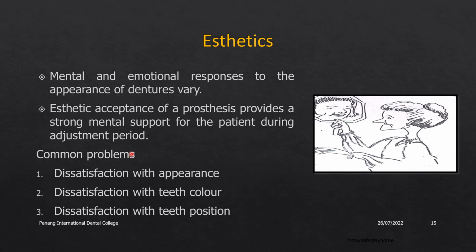Some common problems that may be seen are dissatisfaction with the appearance. Maybe the patient is not specifically satisfied with the teeth color. Maybe he wants whiter teeth than the shade you have given. So it is very important during teeth selection to select the appropriate shade of the teeth and to also confirm this with the patient.